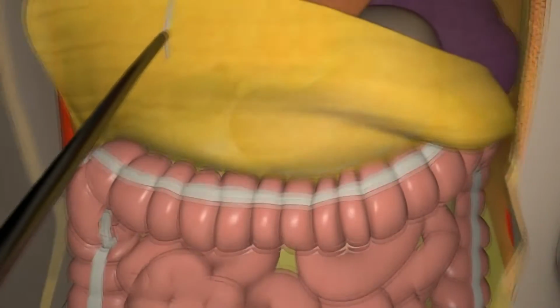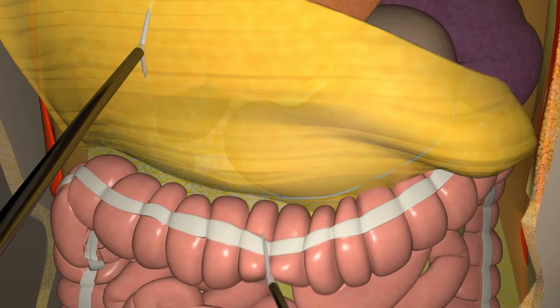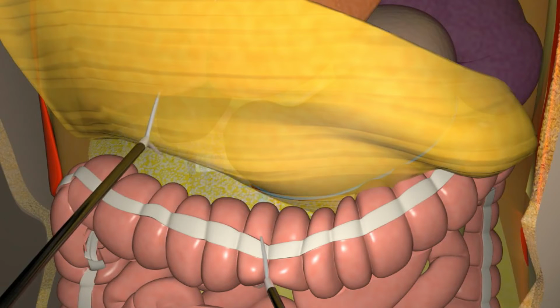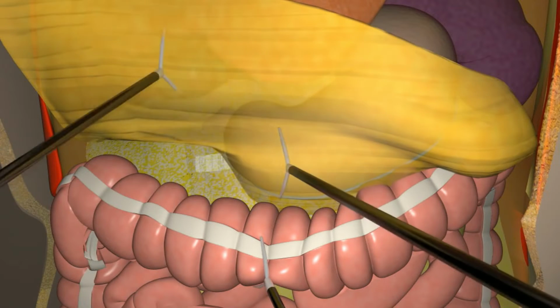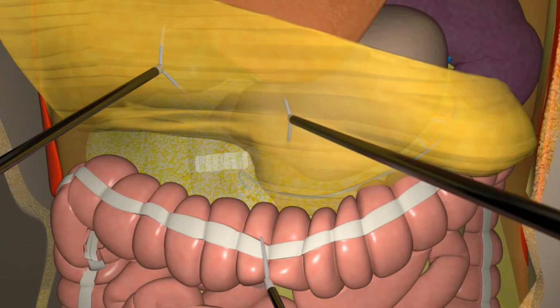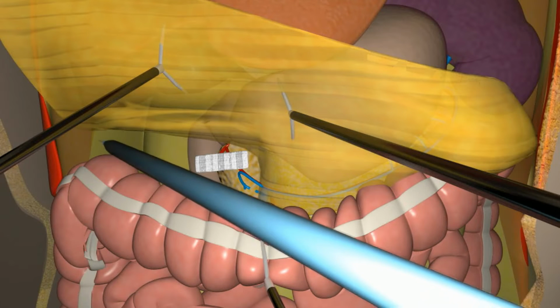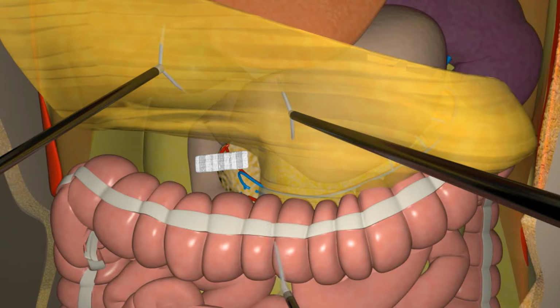In addition to this, the omentum can be preserved unless it is invaded by the tumor. Traction on the ascending colon, medially and inferiorly, puts the hepatic flexure under tension and permits the separation of the omentum. Care must be taken to avoid injury to the gallbladder and the second part of the duodenum as they are encountered while the hepatic flexure is mobilized. The right side of the omentum is taken off the colon by following the areolar planes. Then the lesser sac will be opened.